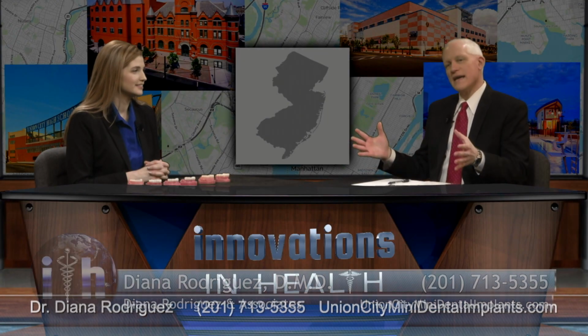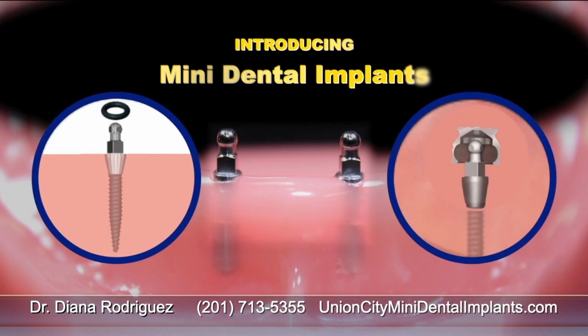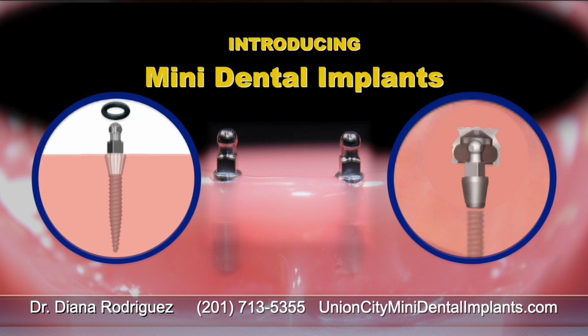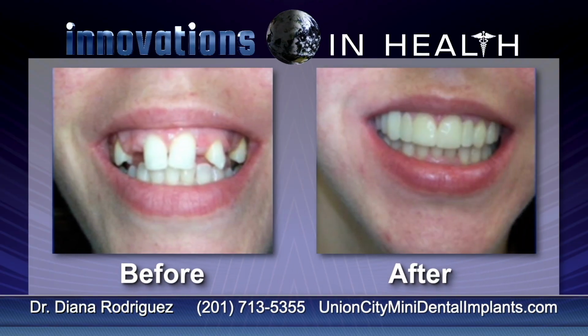Dr. Rodriguez, we're here today to talk about a brand new technique, mini dental implants. It's something that you are doing at your practice, and it can change people's lives. Explain what it is. So a mini dental implant is a type of implant that is minimally invasive. Mini refers to the diameter of the implant. So we can, in most cases, place these non-surgically, which patients love to hear.